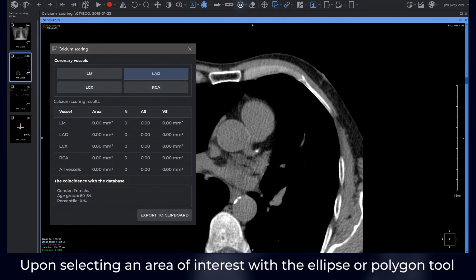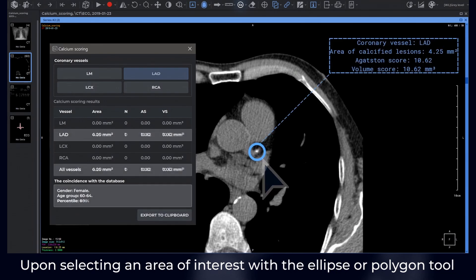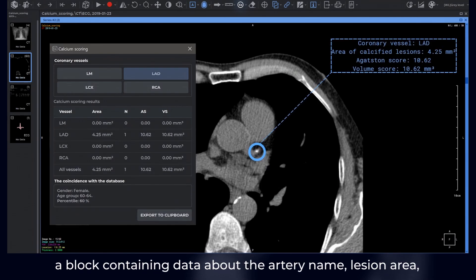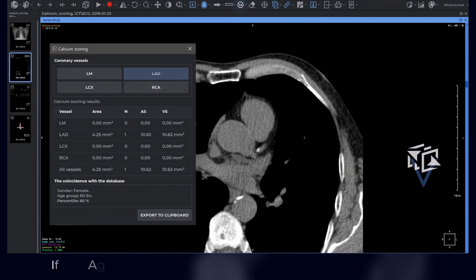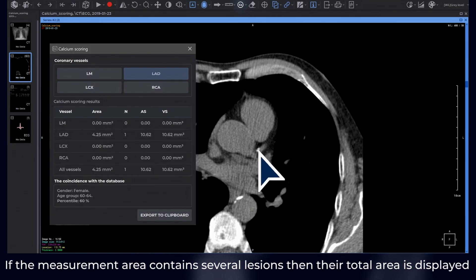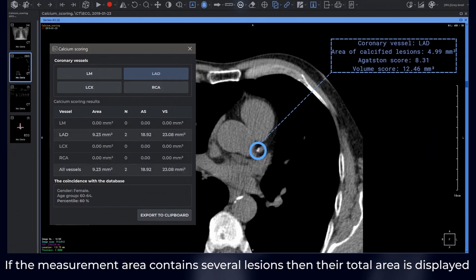Upon selecting an area of interest with the ellipse or polygon tool, a block containing data about the artery name, lesion area, Agatston index, and measurement volume appears. If the measurement area contains several lesions, their total area is displayed.